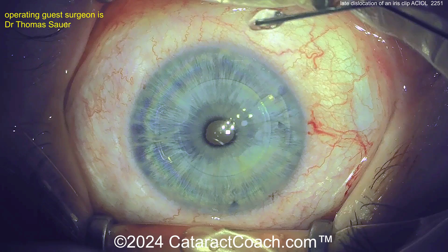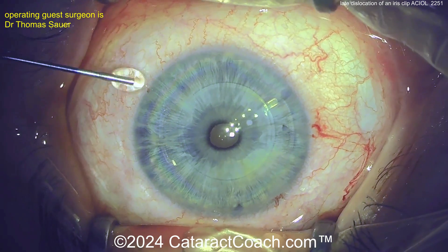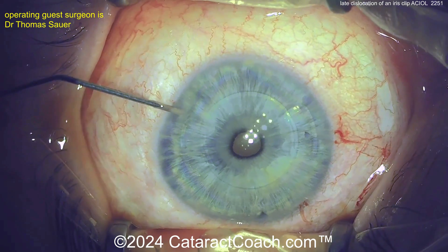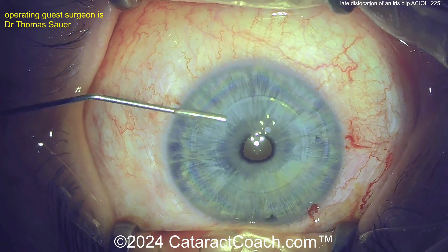This lens is meant for treatment of aphakia, and it's an iris clip design. Now, if the patient still has a normal corneal endothelial cell count, there's probably no harm in leaving that AC lens in position — it's there, it works — but can you refixate it?